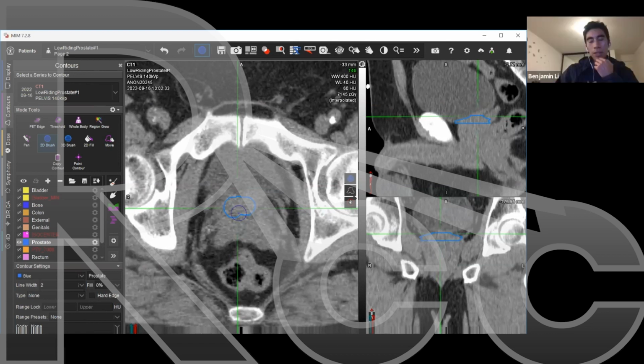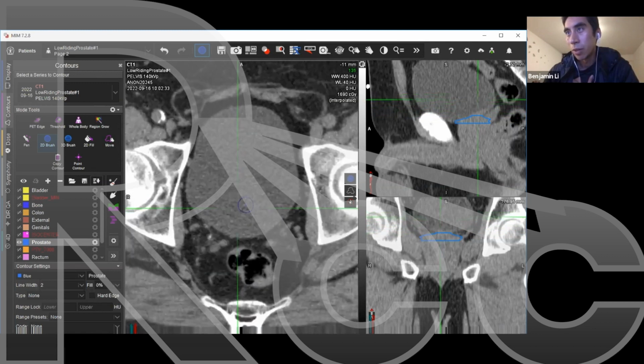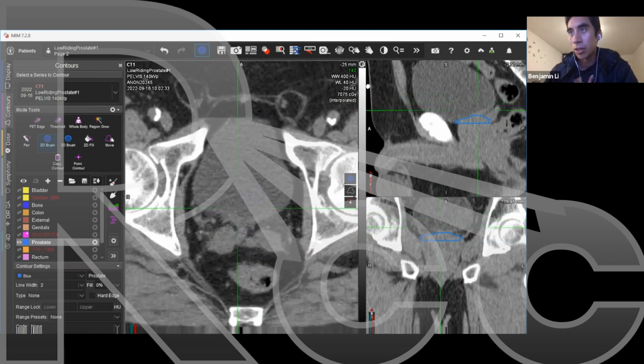We have an interesting question. This is from Dr. Gregorius Prajogi. Are there any tips on contouring the base in post-TURP patients? It seems like in Indonesia and in Myanmar, TURP is quite common, and so a lot of the patients are being treated in this setting.